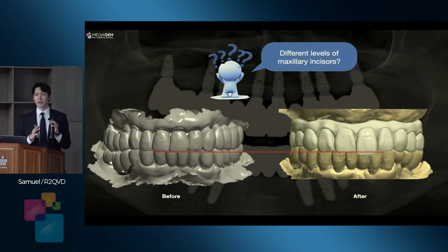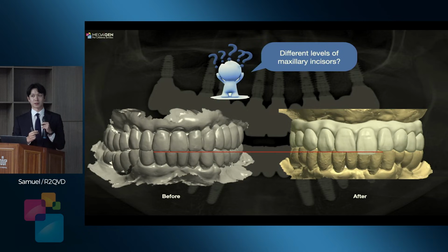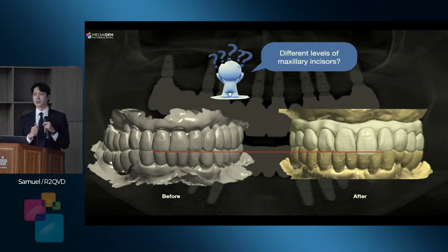So fortunately, he has an R2 Studio. So I asked once again, if you give me the large FOV CBCT with the facial scan, I can make a dental avatar. After that, I will make a digital ideal wax-up, full wax-up. Can you make it? So he said, of course, why not? Just take CBCT and facial scan. After that, when I made the dental avatar, I fully understood.